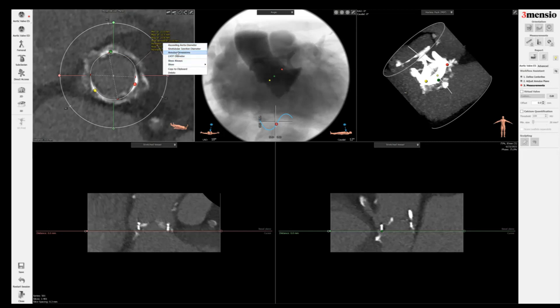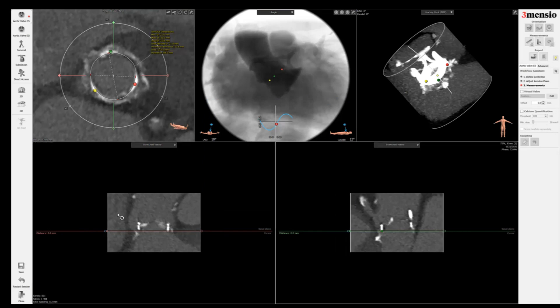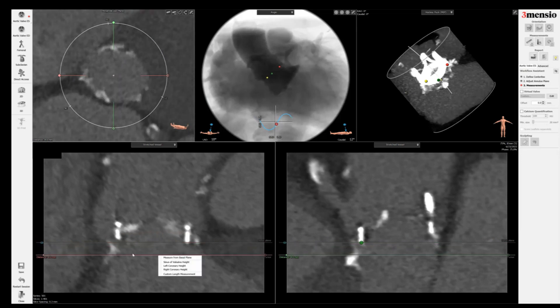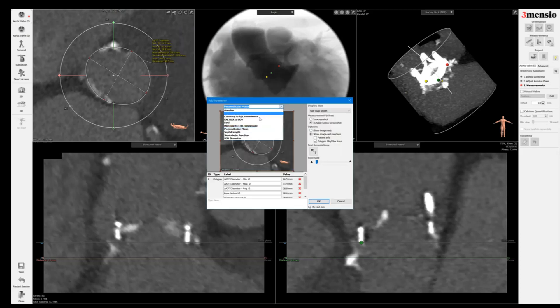I'm going to save this as an annulus and save the screenshot. Next I'm going to measure the LVOT. The LVOT is less relevant in standard surgical valves because you rarely interact with the LVOT. However, in patients with a homograft or a stentless aortic valve replacement, you need to measure the LVOT as well because it has relevance to the interaction with the LVOT and the sizing.